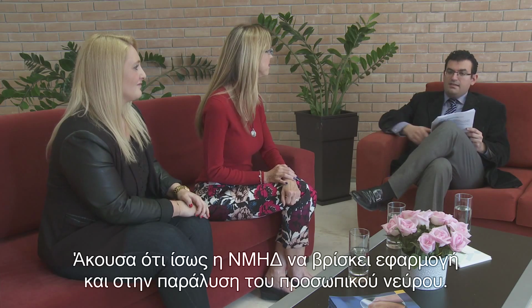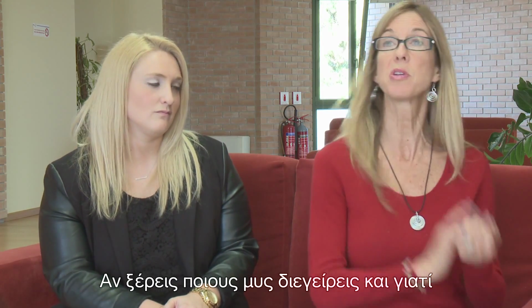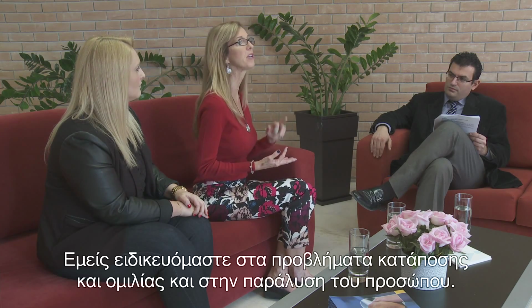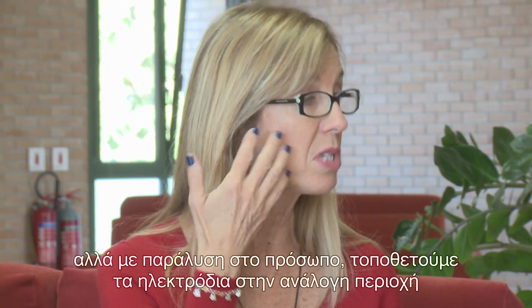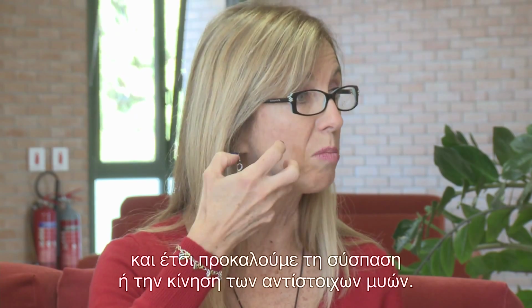I also heard that there is a possible application of the NMES in facial paralysis. Since you can apply the electrodes in the mouth, then what can we do in cases of facial palsy? Well, in the same way, if you know what muscles you're stimulating and why, you can use this technique particularly for any muscle in the body. But our specialty, of course, is for swallowing problems, facial palsy, voice problems. So absolutely, a patient without any specific swallowing problems but has a facial paralysis, you apply the electrodes in the area of interest, and then you're able to evoke or to cause those muscles to contract and move.